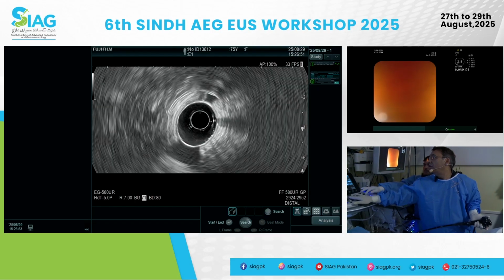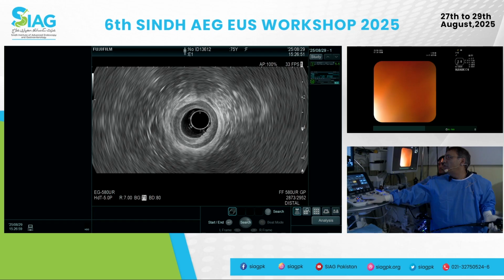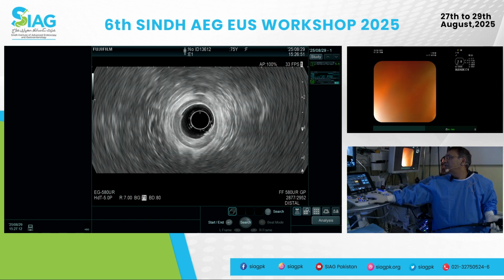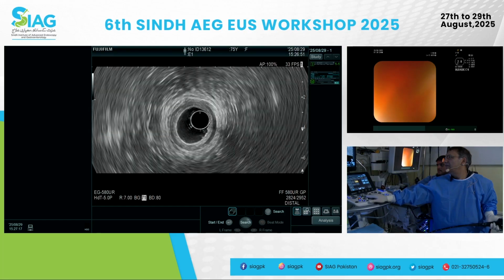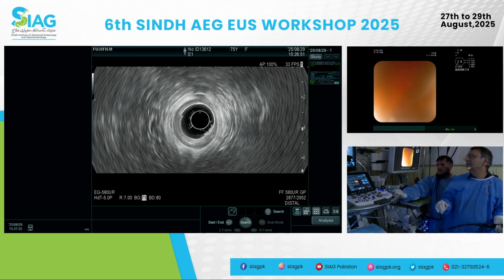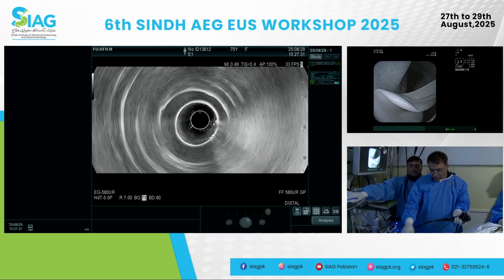Okay, one minute. So right here, you see how it's becoming a little bit more fuzzy, and then it mixes with the external sphincter right here. Okay. And coming out, coming out. Okay, that's inside, coming, coming, coming. Right there, that's where it's meeting the external sphincter. Right there. Okay. We are already out of the anal canal. So, questions?